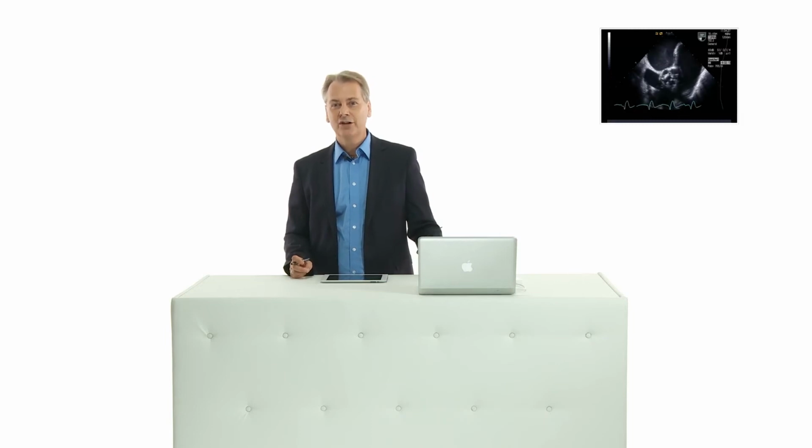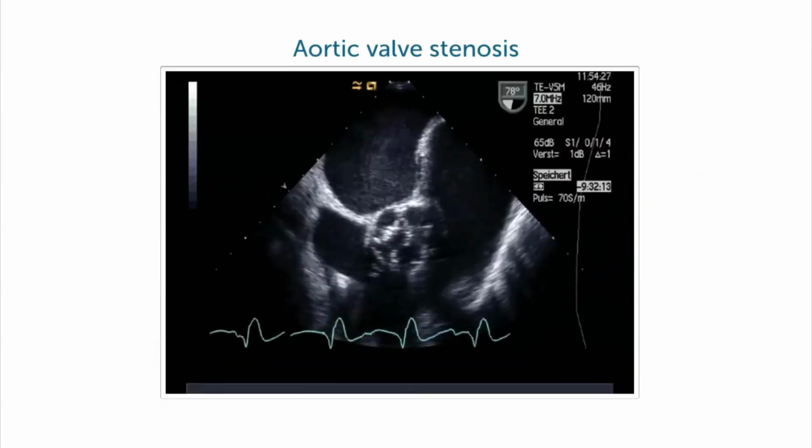And here is a pathology that not only cardiologists but also anesthesiologists see very, very frequently: aortic valve stenosis.